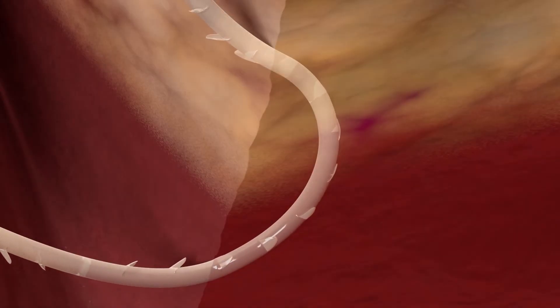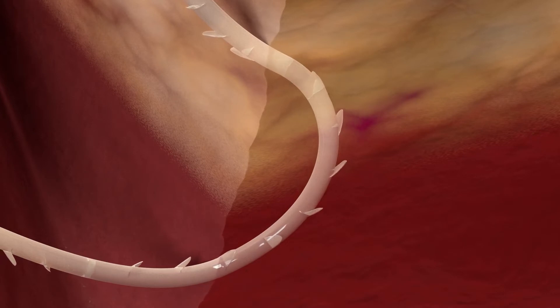The barbs on the Quill device retract flush with the suture during deployment and then anchor into the tissue for secure fixation.